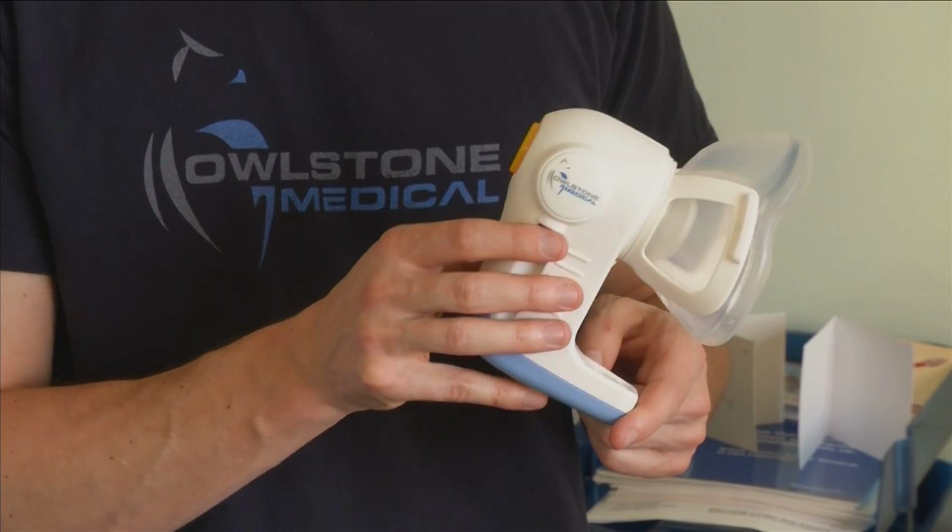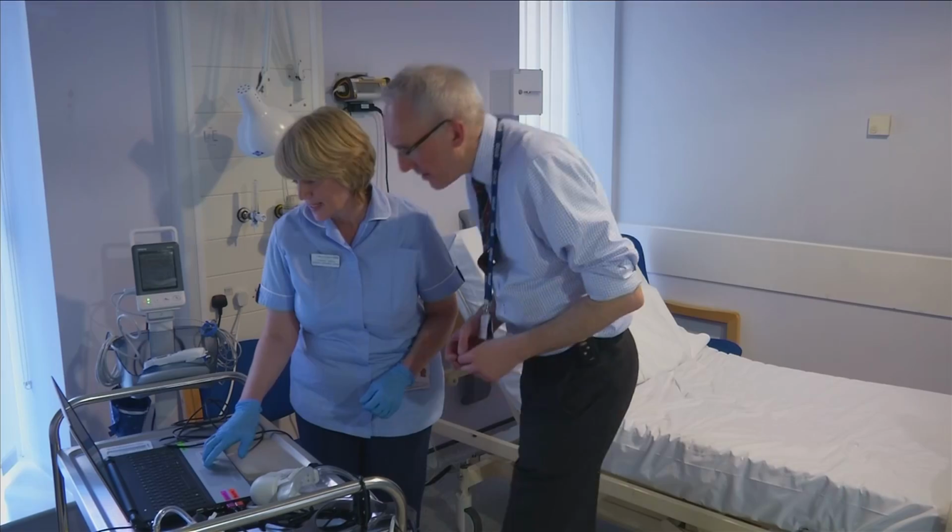Historically, chemical analyzers take up half the size of a room, cost $1 million. So what we've been able to do is use microchip technology to shrink it down from these massive devices down to something about the size of a button. And once it's in that form factor, you can build it directly into these disease breathalyzer technologies.